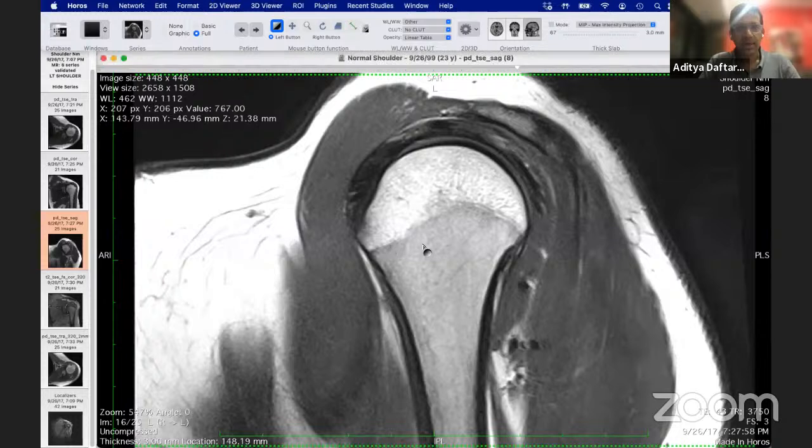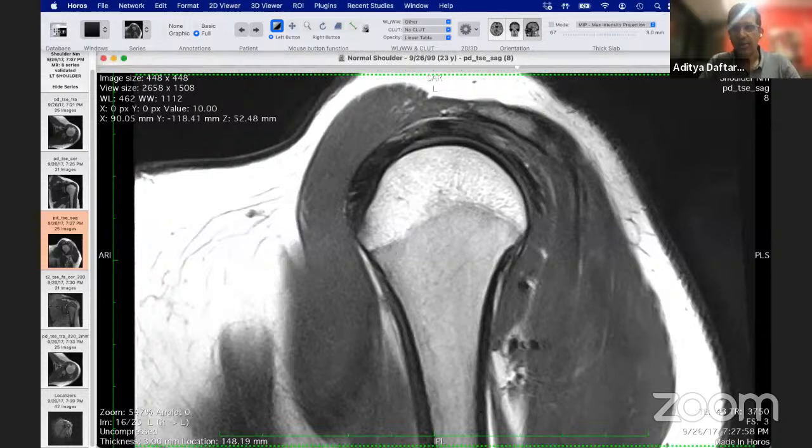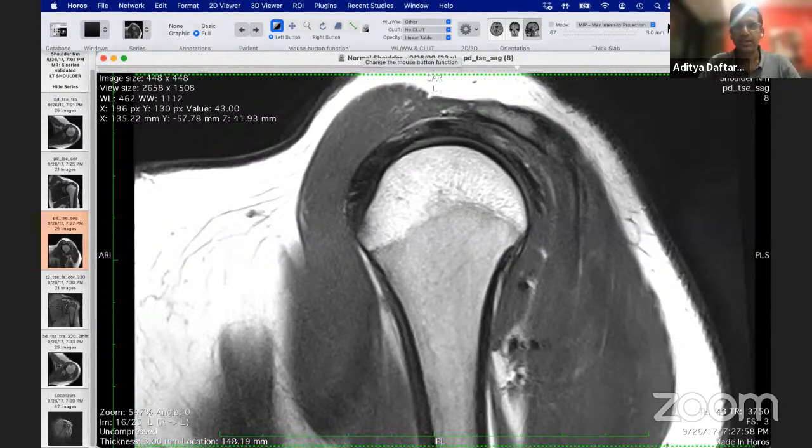We went through the anatomy in the first session. The second session was about the anterior instability-related issues. Today's session is going to focus on the biceps labral junction as well as the remainder of the labrum. I'm going to go ahead and share my screen. What I'm going to start out with, like we did last time, is go through the relevant MR anatomy that we'll be looking at today.